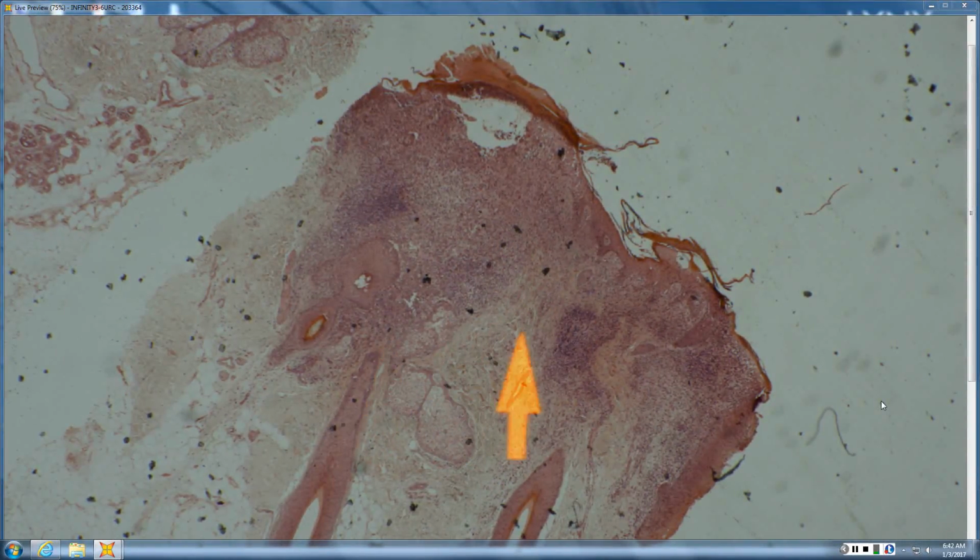Here, for example, these are dark blue small lymphocytes, whereas most of this is these paler, larger cells with a little more cytoplasm. As you start to get an eye for it, you figure out that that's not quite what you'd expect to see with a bunch of pink neutrophils or blue lymphocytes.